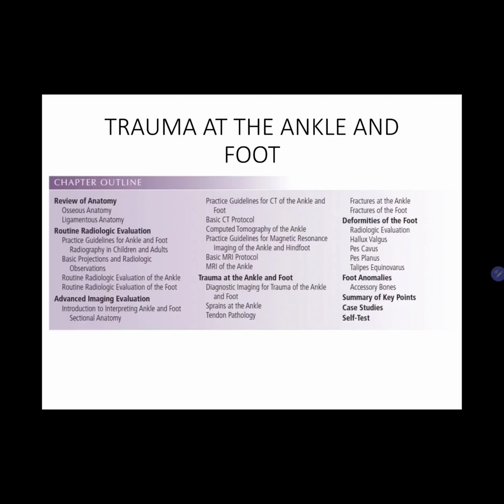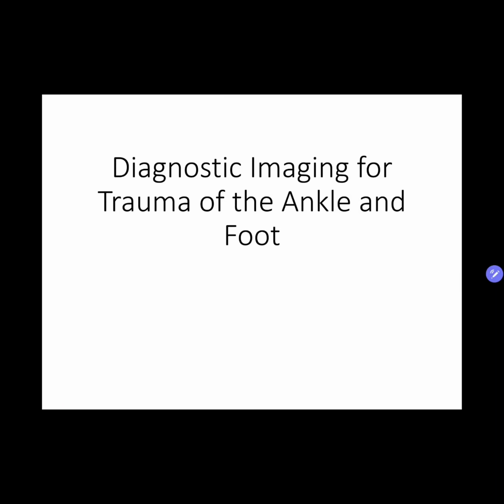Right, for trauma at the ankle and the foot, we're done with the review, we're done with the routine radiologic evaluations, we're done with the advanced imaging evaluations. We're going here now. All right, so diagnostic imaging for trauma of the ankle and foot.